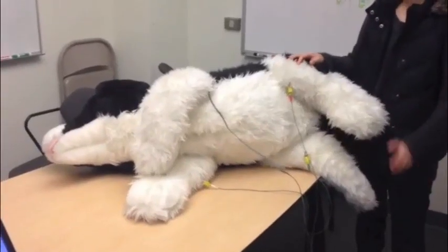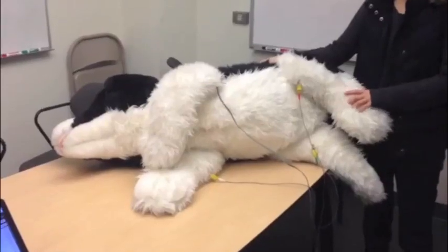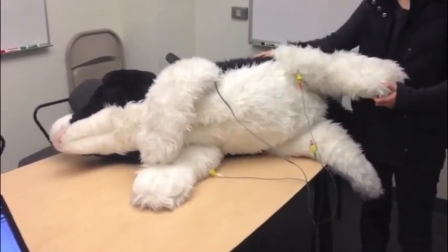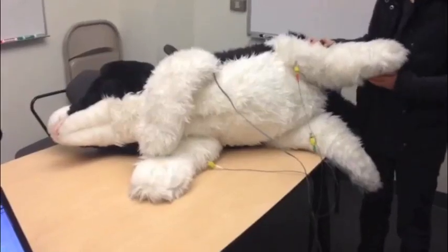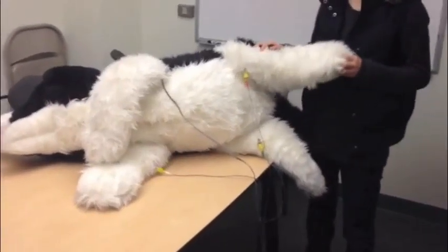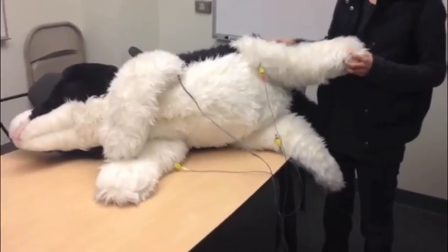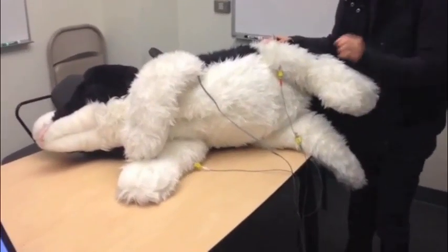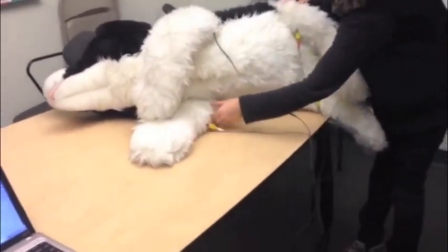Okay, so I'm going to show you how you put the leads on a patient. You want to have your patient in lateral recumbency. You also want to have the legs not bent or too stretched out, but kind of in a straight line perpendicular to the body. And so we're going to first place the first lead, which is white, on the right front here on the skin.